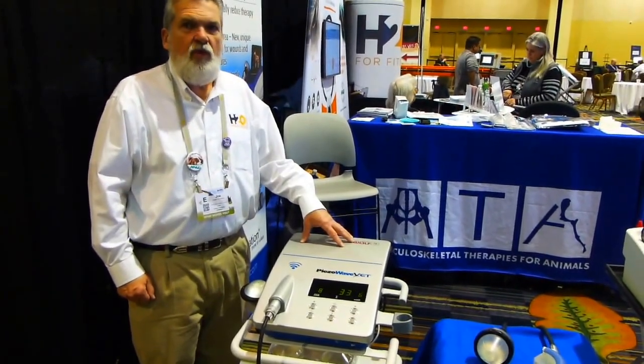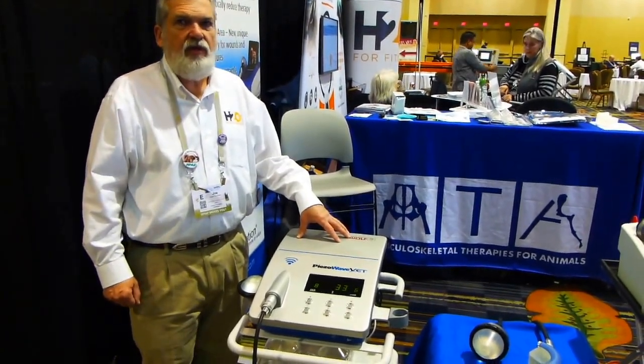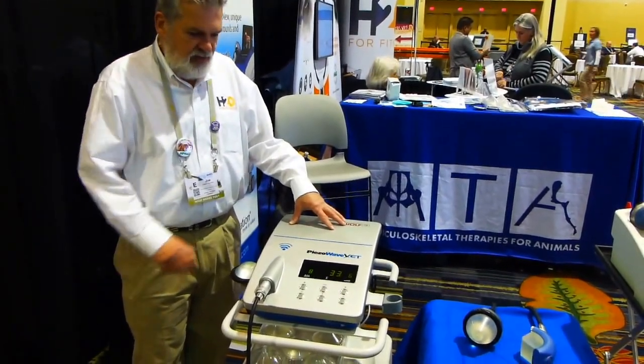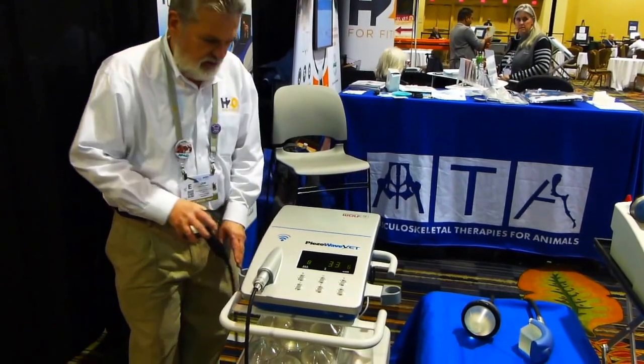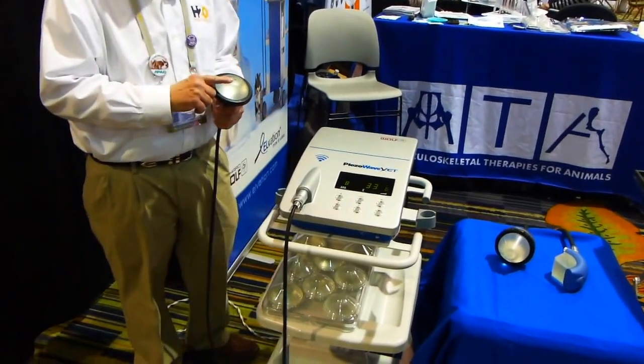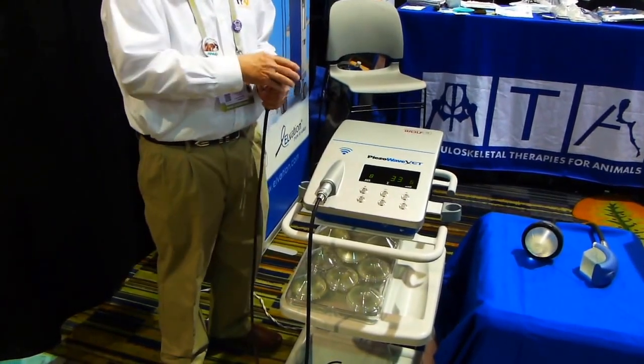This is the PiezoWave VET Extracorporeal Shockwave Therapy device. This is our entry-level shockwave therapy. You can use two different therapy sources, either the F10G4 or the F7G3.